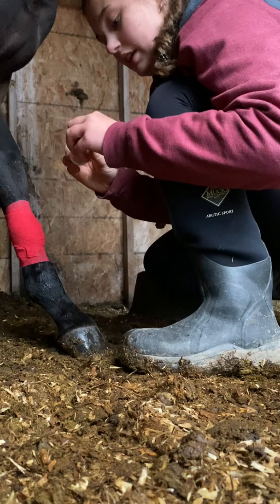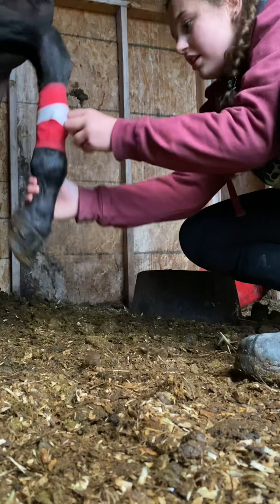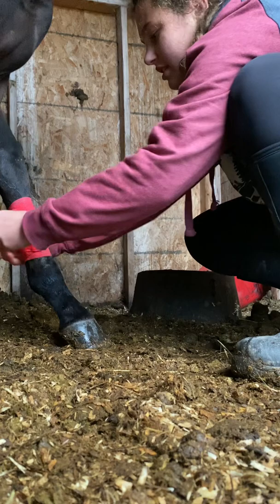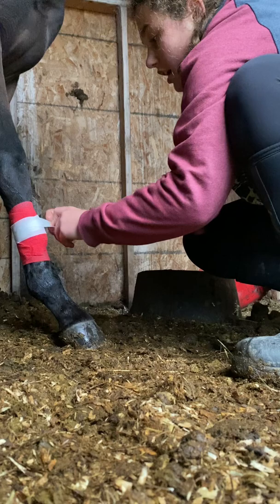And then I secure the vet wrap with some medical tape. With some medical tape, cut the layers so it doesn't fall, and we're done.